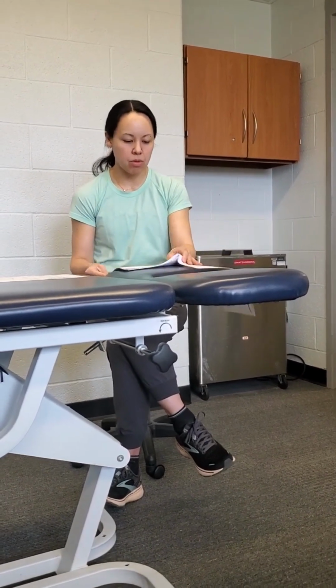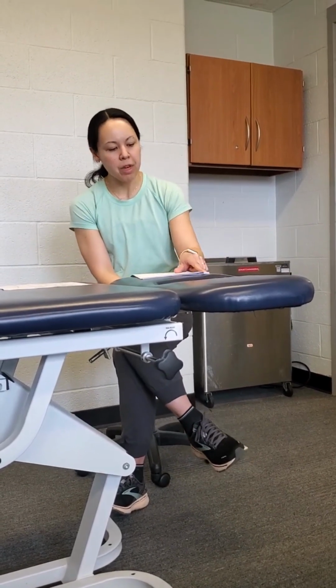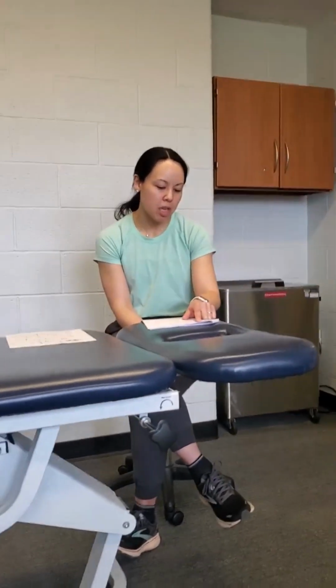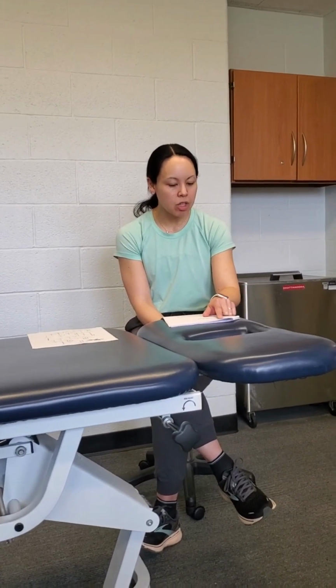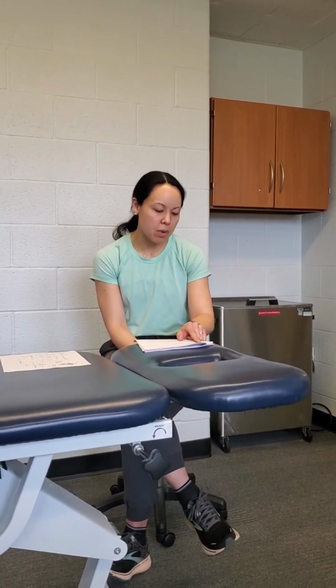And then if we flip over to aerobic BFR, the intensity with the BFR is typically less than 50% of their VO2 max or their heart rate reserve, and the pressure is a little bit lower, so you can do 40 to 80% limb occlusion pressure. Duration is just continuous, while they're on the bike or the arm bike, 5 to 20 minutes. It could even be the whole treatment for that day potentially, and you would do this for a span of about 6 to 8 weeks.